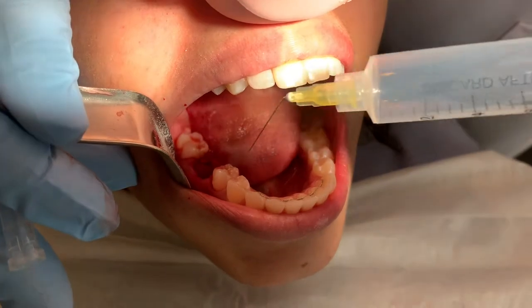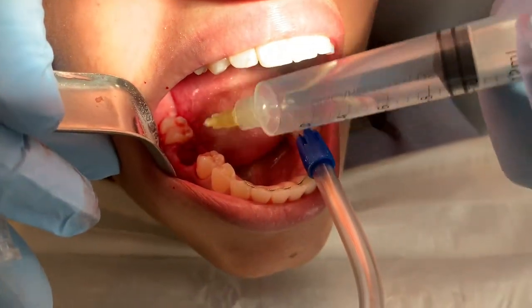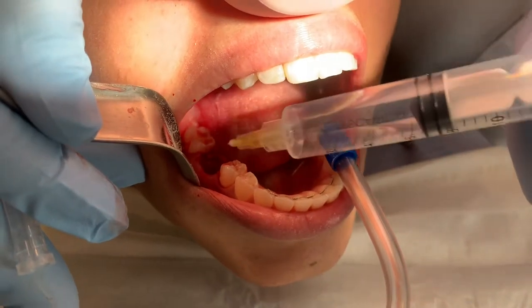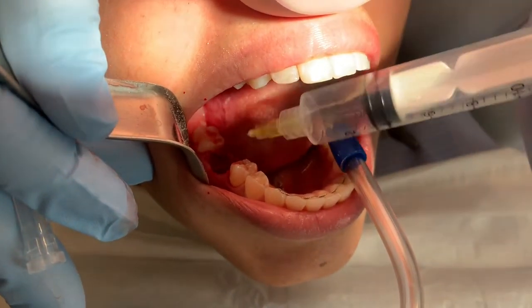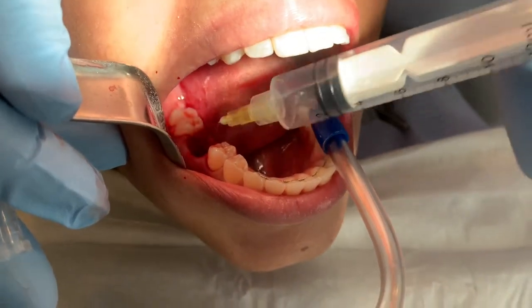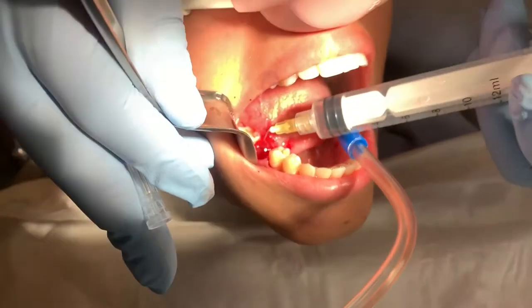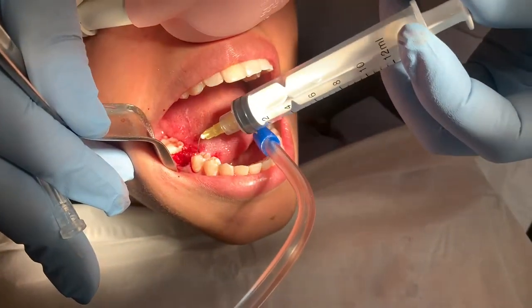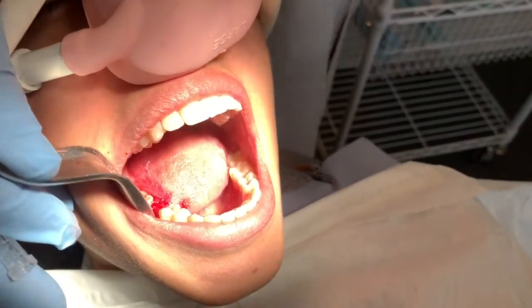This is the ozone and oxygen gas. We more or less will just bubble this down into the extraction site. You can see bubbles forming. The other thing you see here too, there's not a lot of blood, but there's a little bit that lets us know that this bone is alive and healthy. And then the final thing that we do is we put the platelet-rich fibrin in.